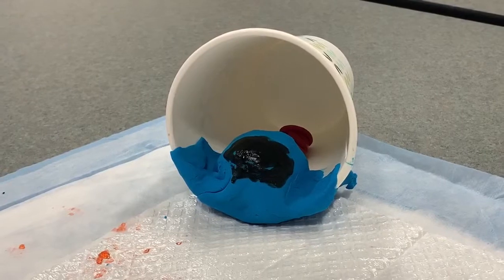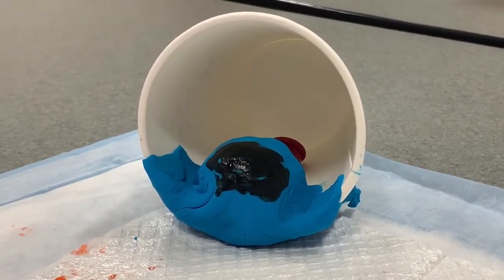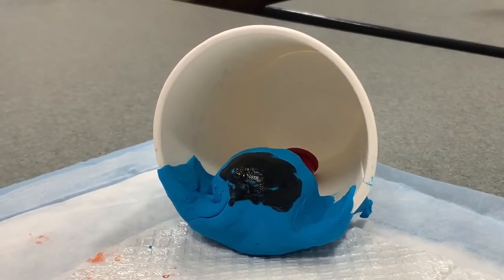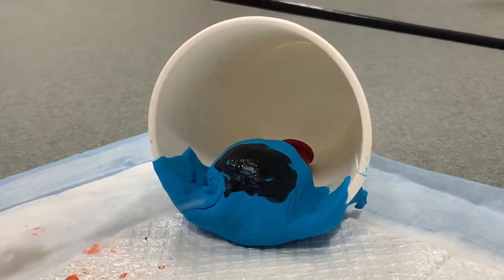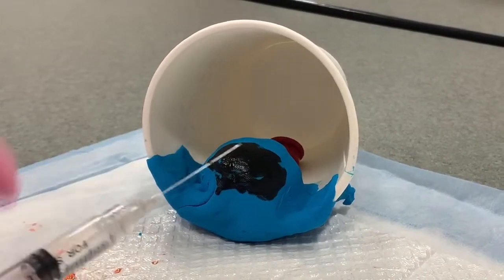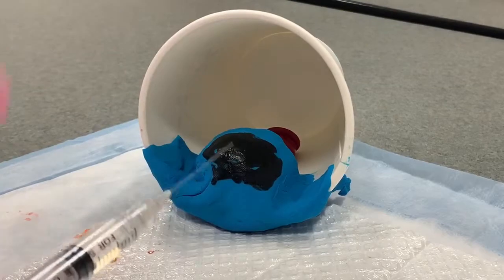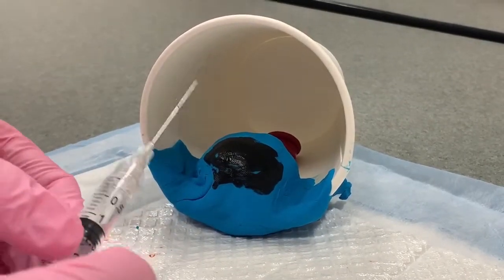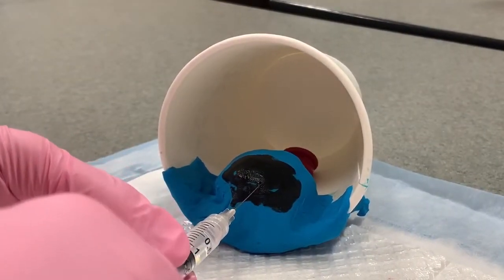Then you will apply local anesthesia. We usually use 1% lidocaine, preferably with epinephrine. We are using a 30 gauge needle that is 1.5 inches long. We are going to make the incision adjacent to the hymenal ring, so that's where I will apply the anesthesia.